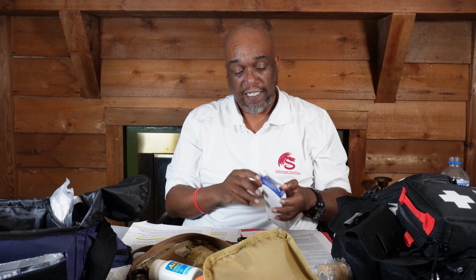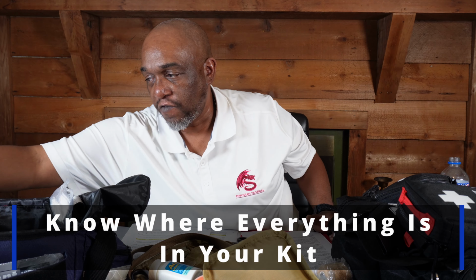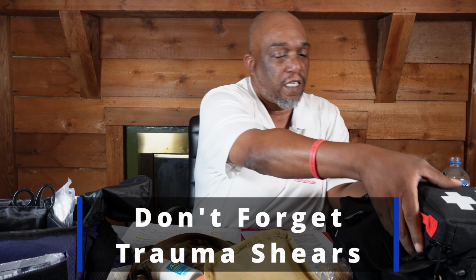And one thing you always want to remember also is look through your kit, more than occasionally, because you kind of want to remember where everything is. One thing you don't want to be doing if you're in a situation is trying to search and see where all your stuff is. So just kind of go through your kit, know what you got. So like I said, most important thing is tourniquet, hemostatic gauze, bandages, alcohol pads, ibuprofen or whatever kind of pills you want to use, and nitrile gloves. Those are kind of like the most important things. The other stuff are just kind of stuff that to me is important, but you don't necessarily have to have.